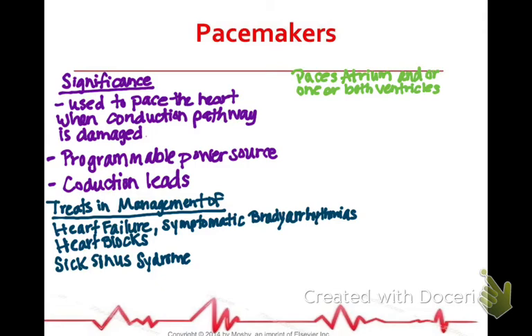It really depends on what's going on and what type of pacemaker you have. But you can have one that paces the atrium and the ventricle, just the atrium, or both ventricles. But most fire on demand when the heart rate drops.